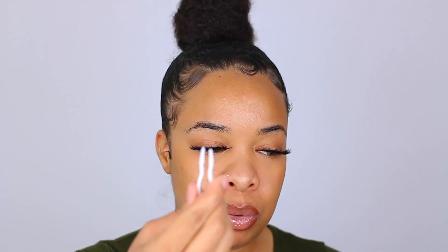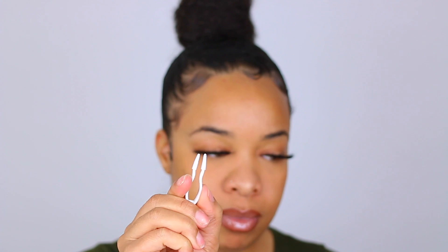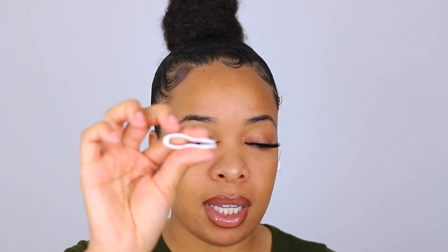They also offer a tool that helps you remove them. This tool just has two little rubbery pieces on the end and it's really, really easy. I'm going to show you guys quickly how I remove them.